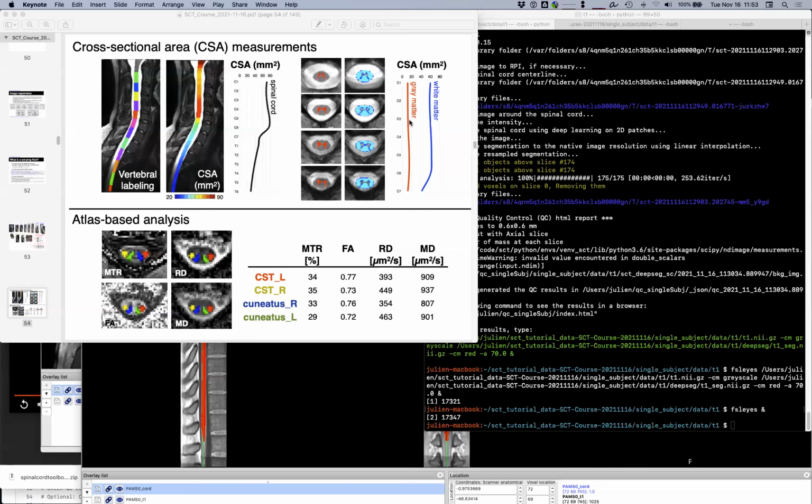And it's the same with the brain, right? When you do brain studies, you don't know exactly where the corona radiata is located. What people do is a diffusion scan, get the tractography, and then from the tractography pathway, they estimate the likelihood of the location of the corona radiata, but we don't see it with MRI. We can only estimate it.